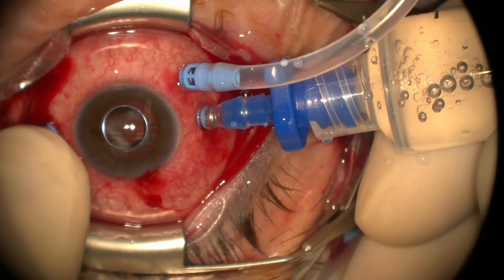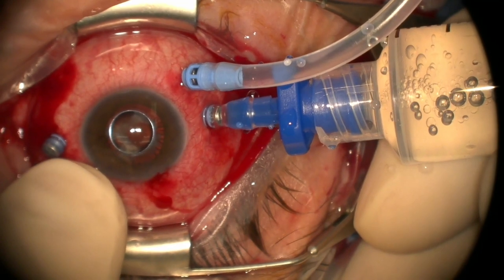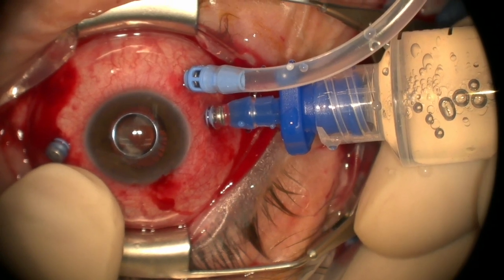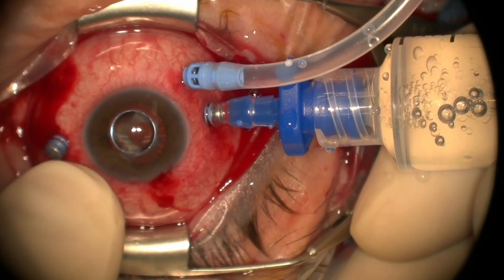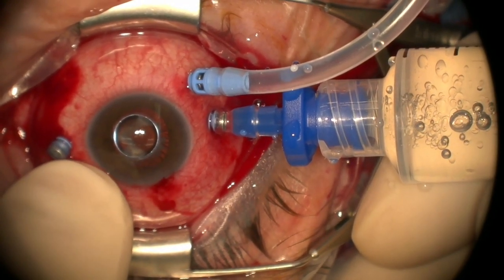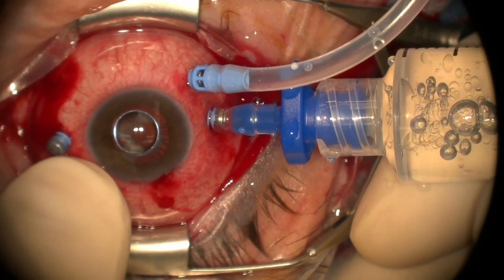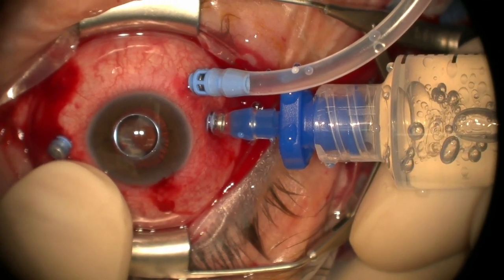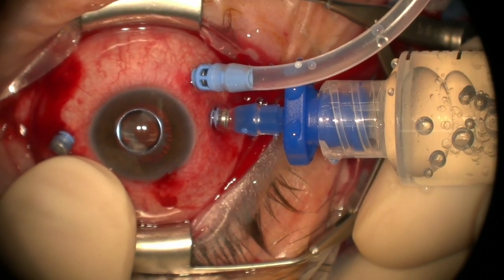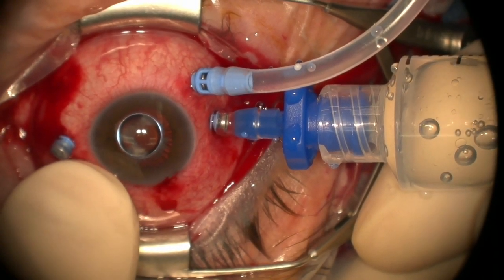And we're just down to the final few drops of the oil. So you hear me kind of back off the pedal a little bit, try and direct the cannula. I'm bending the cannula in a way towards the iris, right? Trying to get the last of the oil without hitting the fluid pockets and really creating a problem. You can see the water coming in now a little bit, along with oil, both. You see the oil and the water hitting into the syringe.